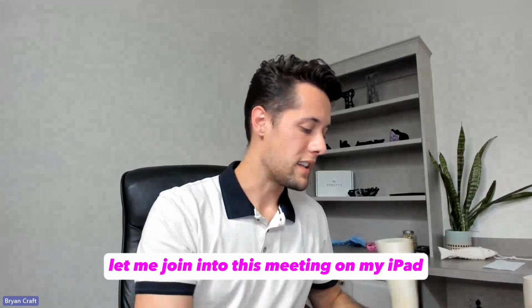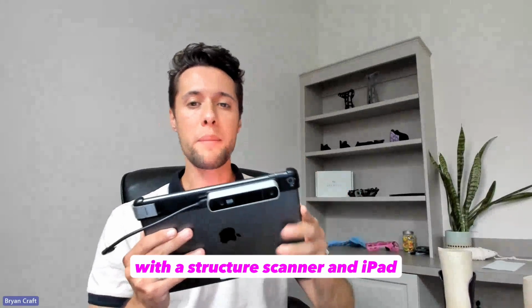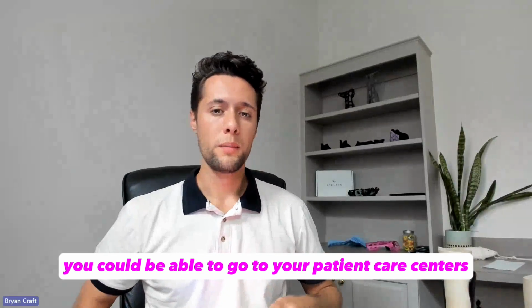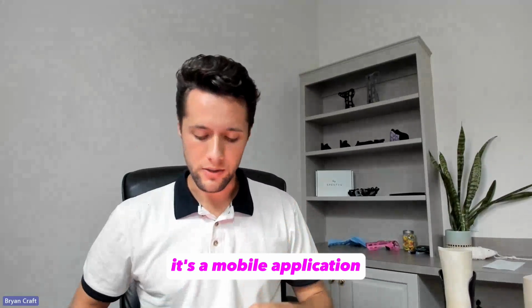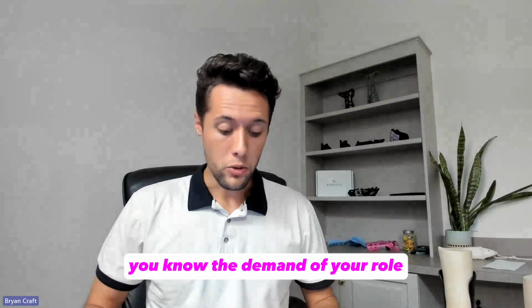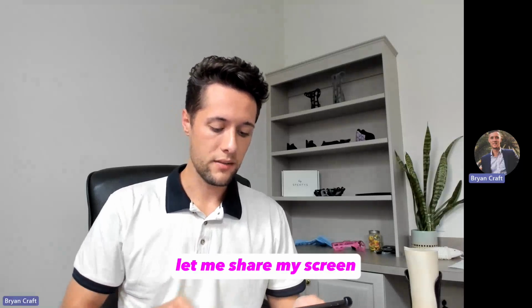Let me join into this meeting on my iPad. Spentys is an iPad app. With a structure scanner and iPad, you could go to your patient care centers, your rehab centers. You go to the patient's home, whatever you need. It's a mobile application, so that's quite nice to address the demand of your role. Let me join in here. Let me share my screen.